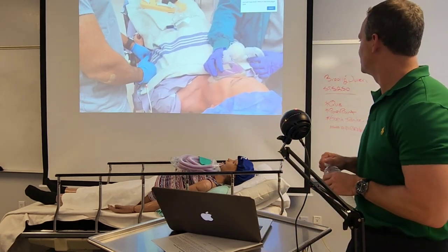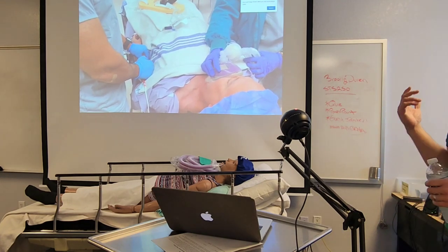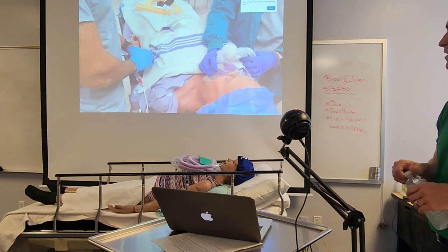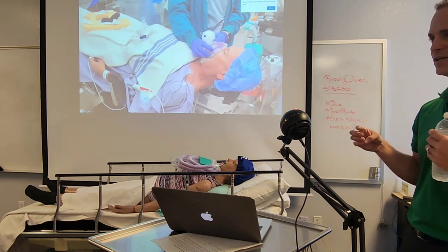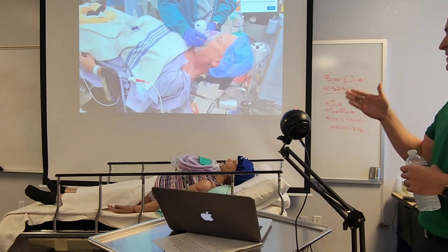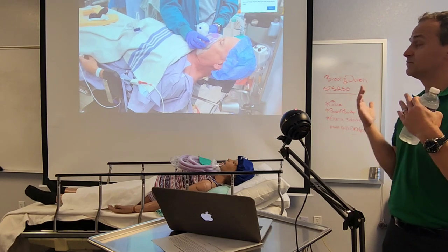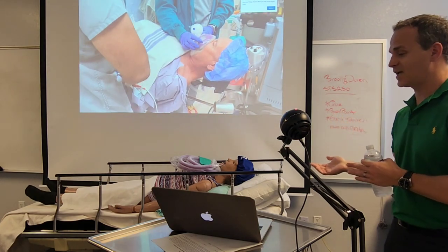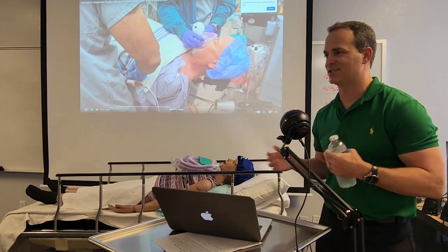Deep breath. So right here, this guy is breathing in high flows of oxygen. If you saturate all the tissues in the body with oxygen for like, let's say 10 big breaths, it buys us time to place an LMA or a breathing tube, just in case their anatomy is terrible and they're a difficult intubation. So like they're not able to breathe while you're doing it? Right.